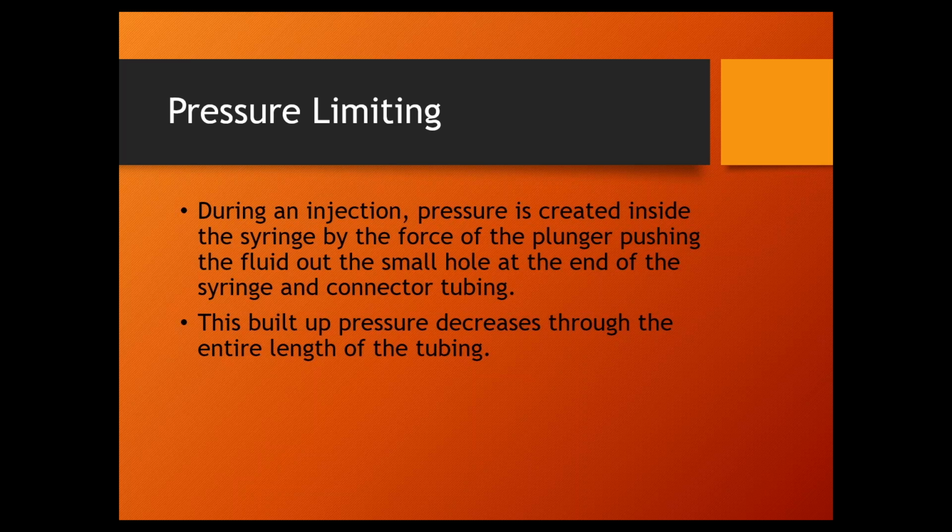Anything below this is perfectly fine. As a matter of fact, most of your shots are going to be double-digit pressures. It's relatively unusual for CT and MRI injectors. For just CT and MRI, it's relatively unusual to get over 100 PSI in the syringe during a CT or MRI procedure.